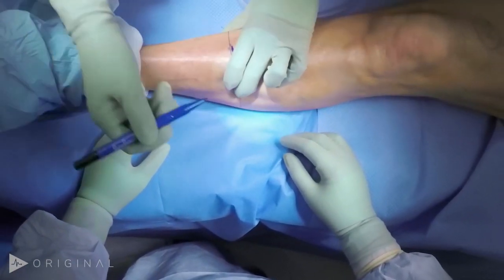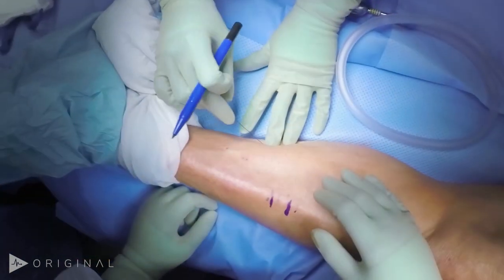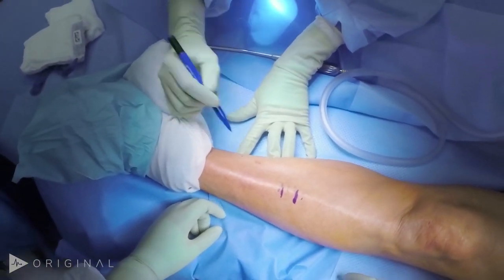This is an instructional video on how to perform a below knee amputation. I'm Dr. Joe Rapp, and we'll be narrating the video of an operation performed by Dr. Jade Hiramoto.